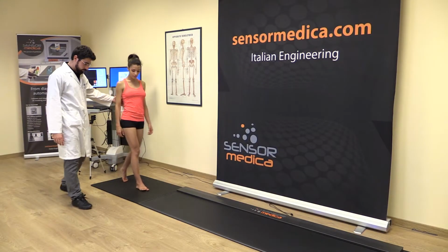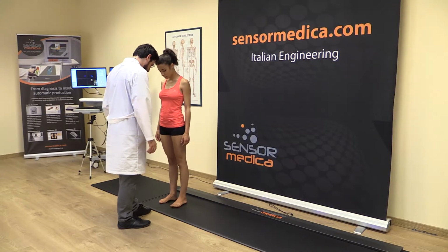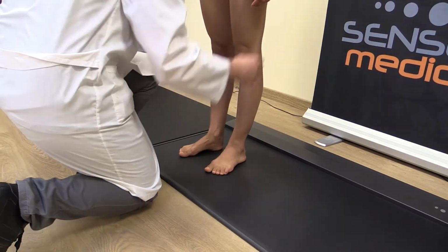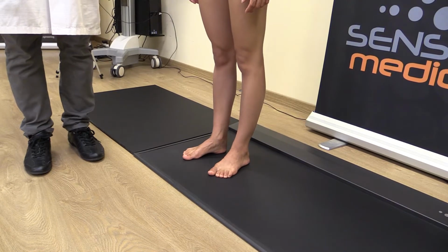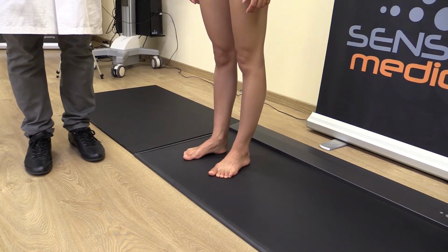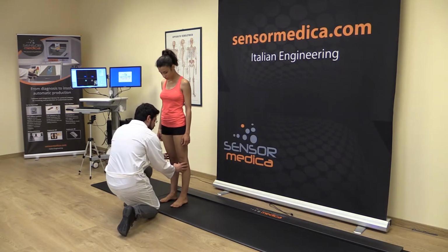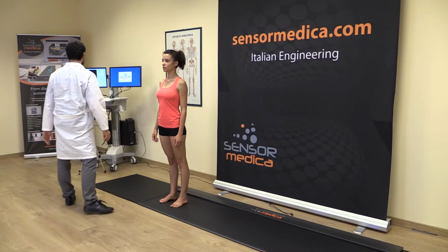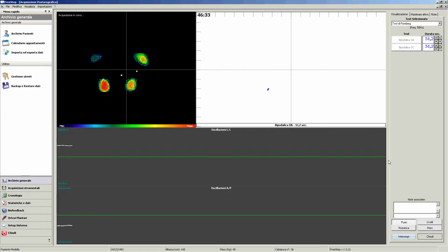Let us place the patient on the platform with his feet in a comfortable and unconstrained position. But anyway, it is better if between the two feet there is a maximum distance included between the trochanteric width and the shoulder width, and if the heels are aligned on the same plane. The patient must remain standing, relaxed, face forwards, and his arms down at the sides for the whole duration of the exam. We can proceed with the acquisition of the pressure measurements, checking only that the software completes the data collection.